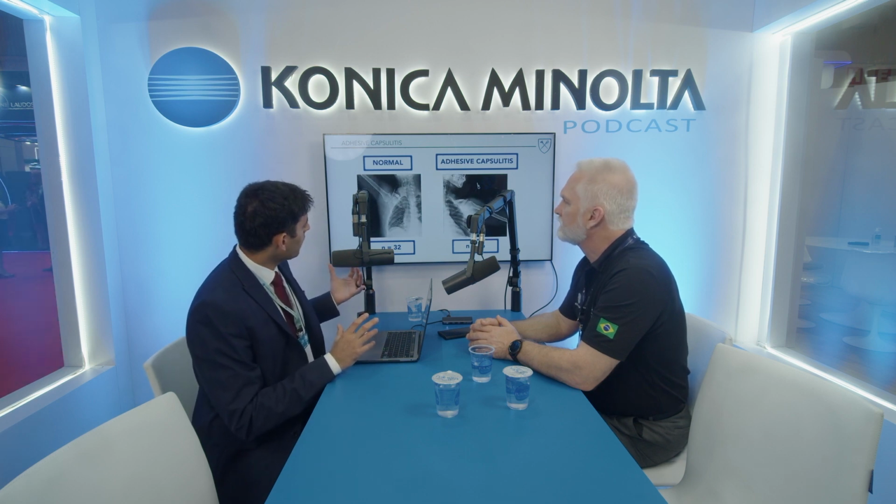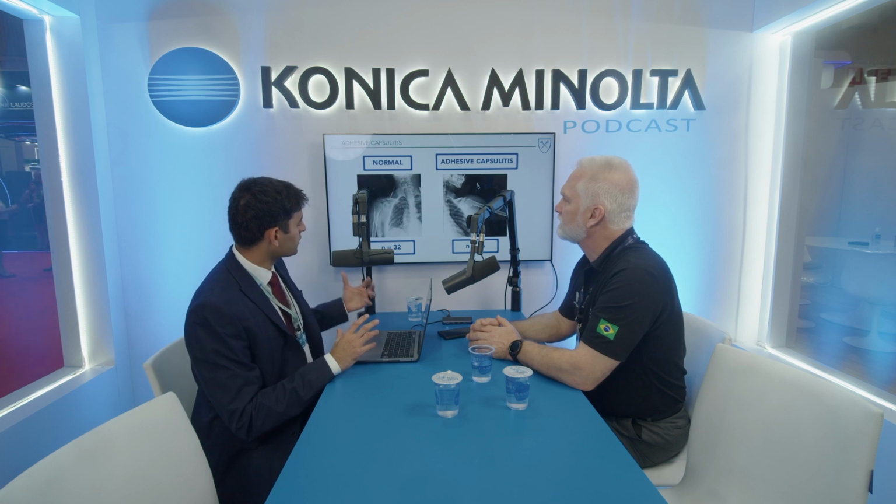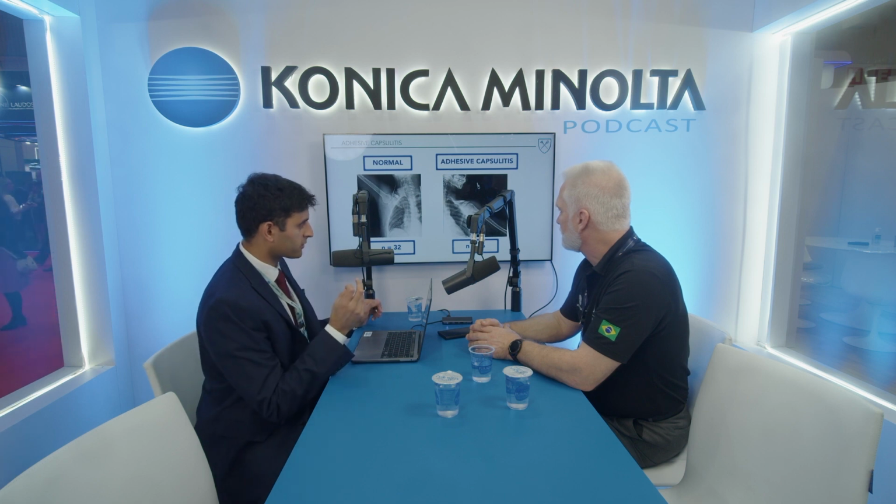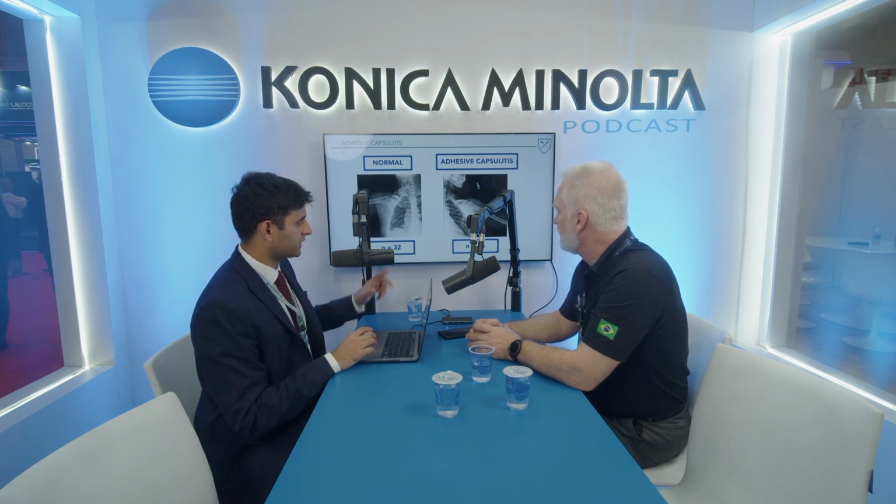So DDR is helping us to really understand adhesive capsulitis as well. As you can see in this normal DDR, the glenohumeral joint is moving nicely. The humerus is elevating within the glenohumeral joint. But in the adhesive capsulitis patient, it's almost as if the glenohumeral joint is fused and all the motion is coming from the scapulothoracic articulation.